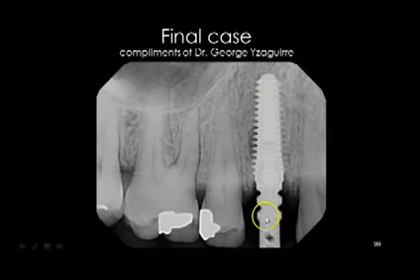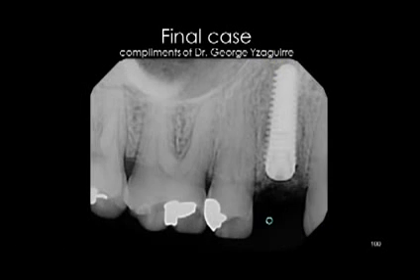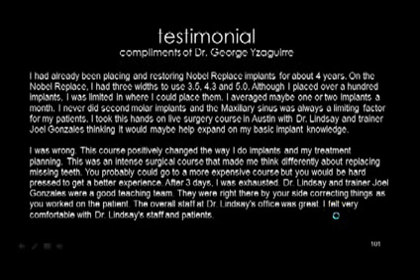If you're malpositioned, let's say you're slightly mesial here, you can very easily remove this pathfinder, put your handpiece adapter back in, back the implant out, and then redirect slightly the implant because of your maximum thread engagement here. Redirect slightly the position of your implant to where it's more in between your two teeth and right where you want it to go. Another advantage to the AnyRidge drilling system because of the threads. Now here you can see the voids filled in with your bone.